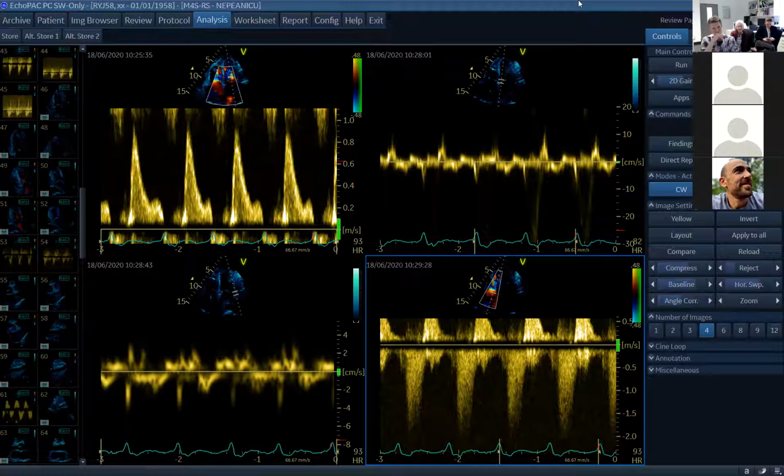Okay, so the septal E prime is about 3 to 4 centimeters per second, and the lateral one is about 2 or 3 or 4 centimeters per second. This is the E wave, I'm guessing E to A. So the E wave is 0.8 and the A wave is 0.2. So the ratio is going to be around 3 to 4. So this looks like, and coupling it with the severe tricuspid regurgitation, which is about 2 or 2.4. No, sorry, 2.2. Yeah, it's only 2.